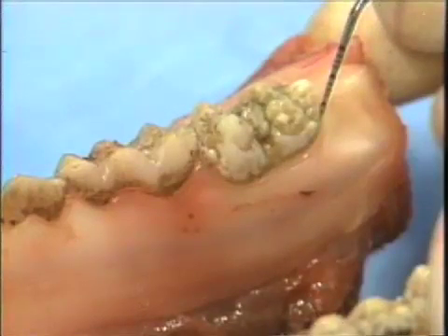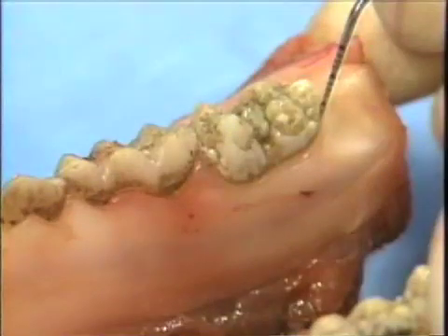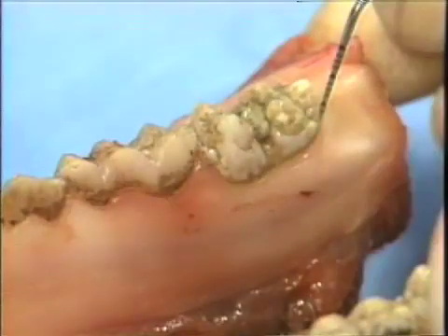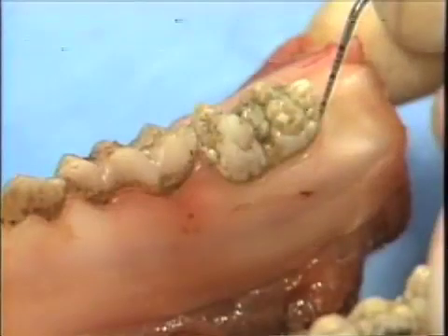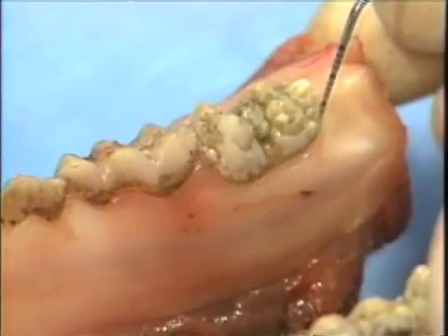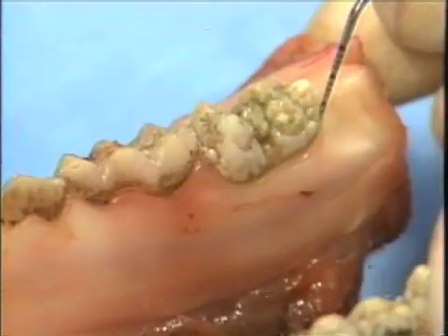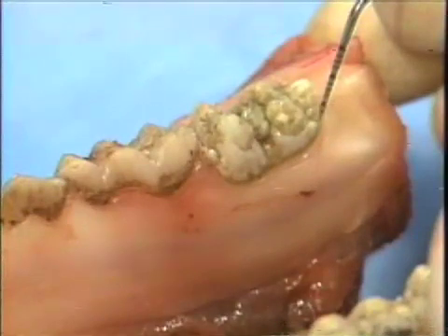In this demonstration, we will show a distal wedge procedure utilizing two parallel incisions. Alternatively, the typical distal wedge with a V-shaped incision could be used. These decisions are based on the anatomy of the area and the presentation of the periodontal problem.